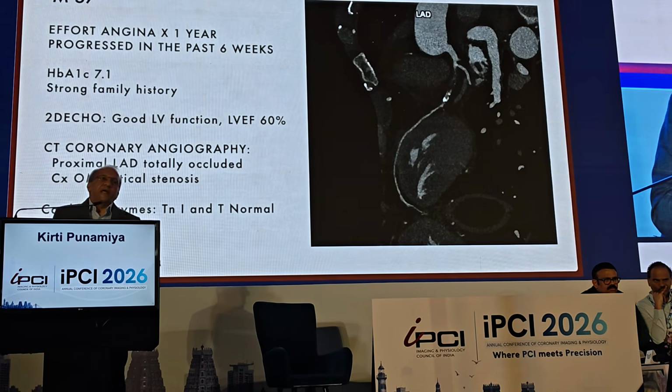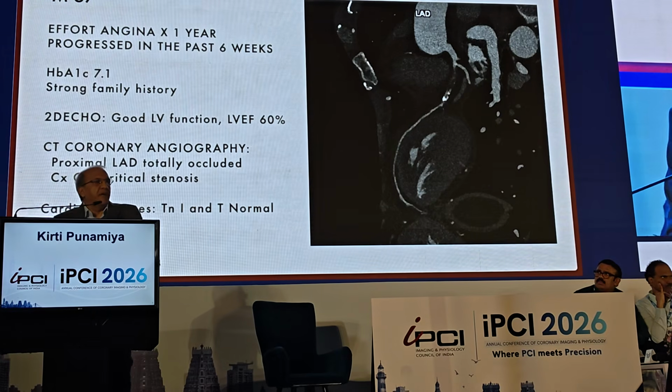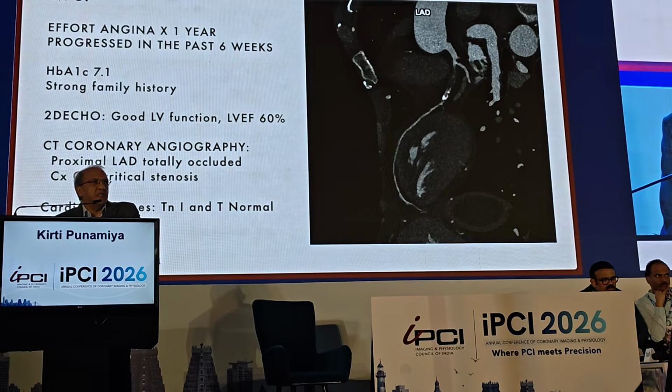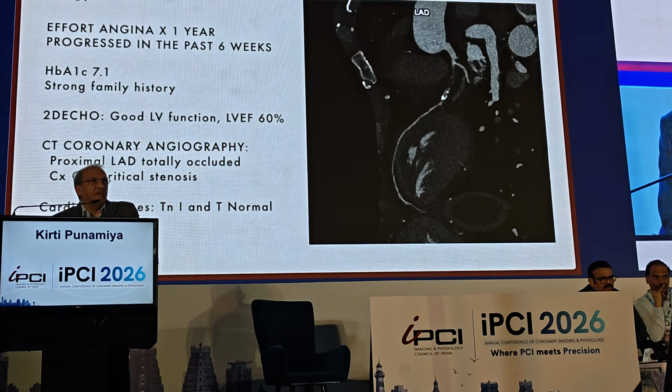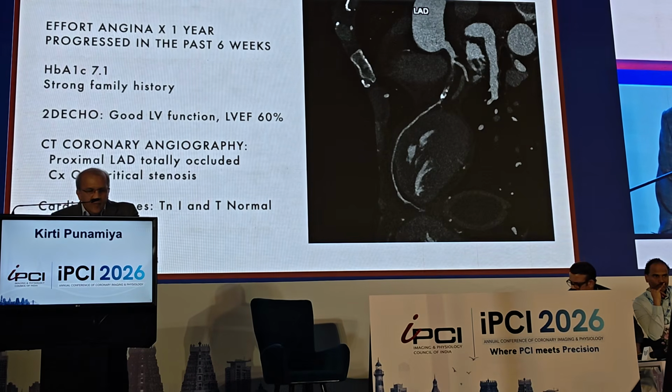So this case actually gave us the path of the wire, and it also showed us the density in the mid-segment was high with a little bit of calcium, which was really the reason why the microcatheter didn't advance over the wire.